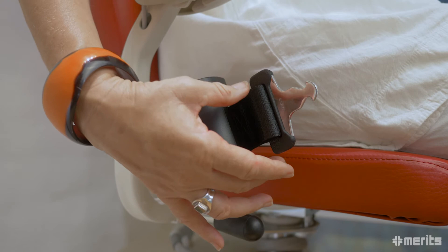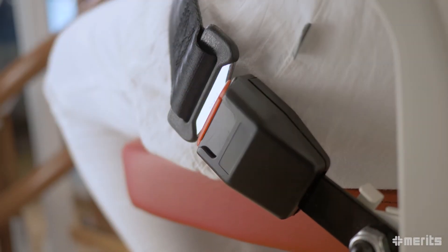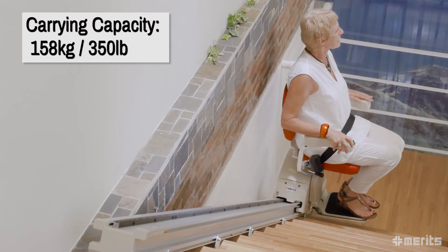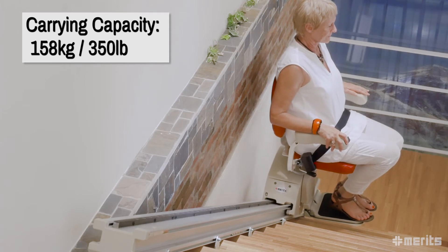For additional safety, the standard seat belt protects the user from accidents. Its strong motor and sturdy frame enable the E603 to have a carrying capacity of 158 kilograms or 350 pounds.